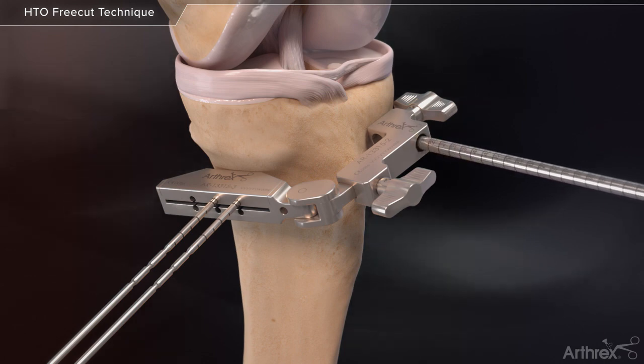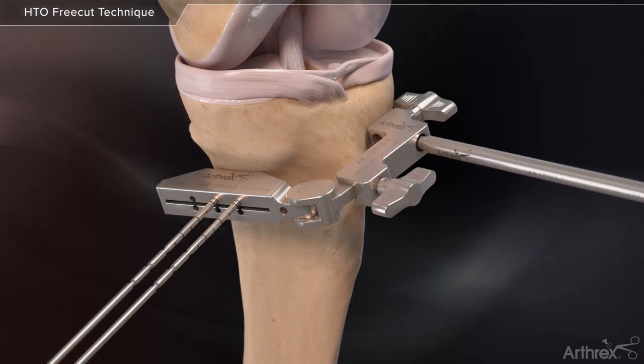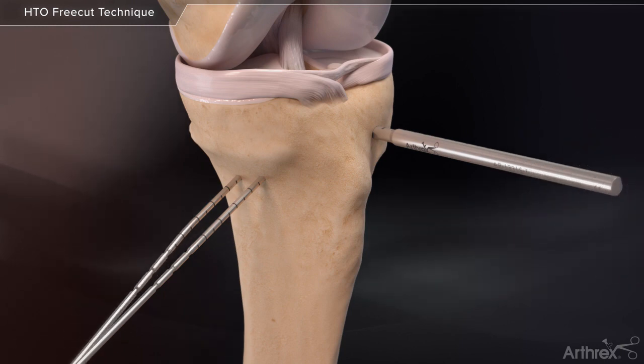The hinge is first prepared with a 5 mm reamer, then replaced with the hinge pin, creating a terminal stop for the osteotomy. The osteotomy can be made through the cutting guide or removed, retaining only the hinge pin and guide wires.